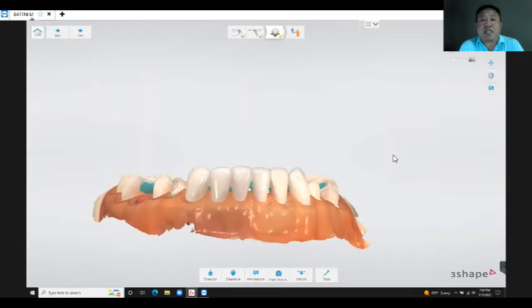We tried both scanners because I find that after scanning the teeth are more towards a pink color. So I tried both scanners and tried scanning and still showing the same. So what we found out is the light in the room contributed to the color and the shading of the teeth.